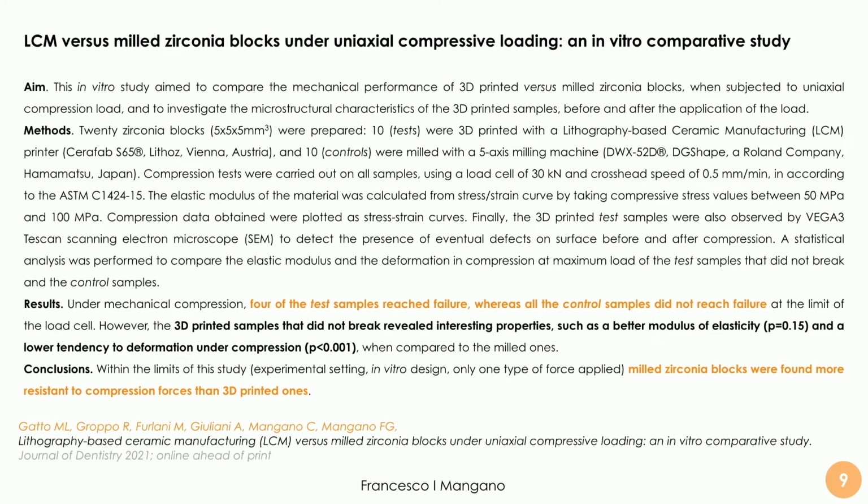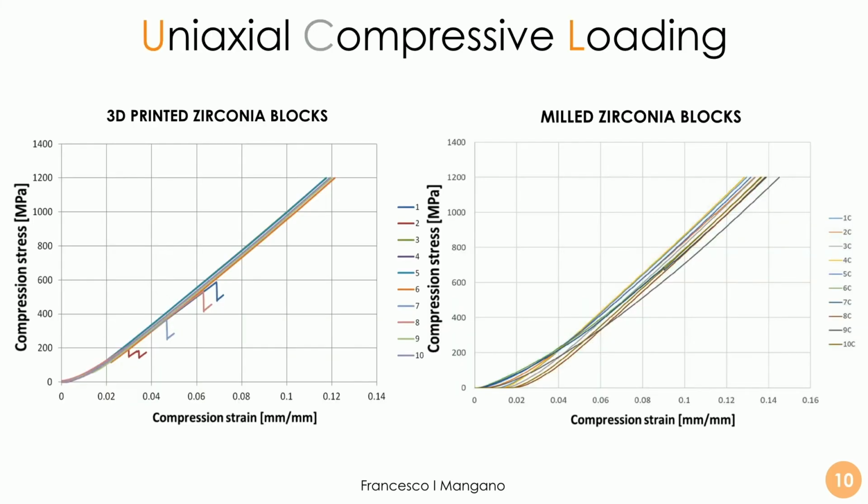And considering that the forces at which the test samples reached break and failure were very high, we can consider that the results were very interesting despite the limits of the study, the experimental setting, the in vitro design, and only one type of force applied. We can say that yes, there's a difference between the test and control samples, but both samples behaved very well. This article has been published recently online in the Journal of Dentistry.